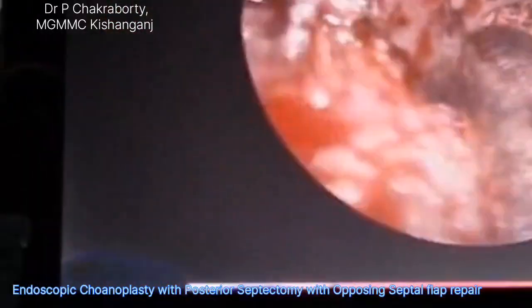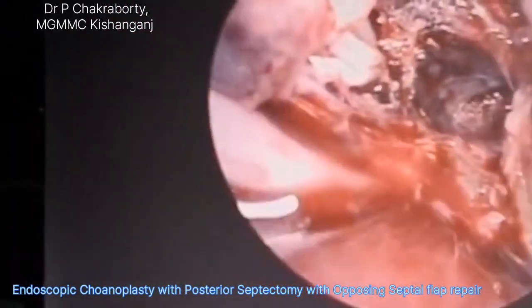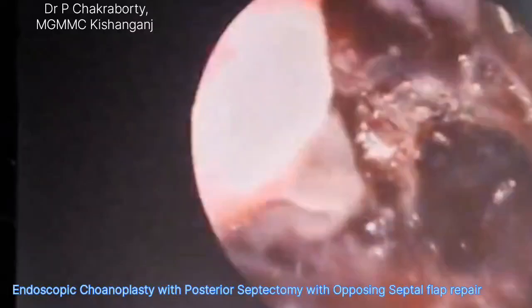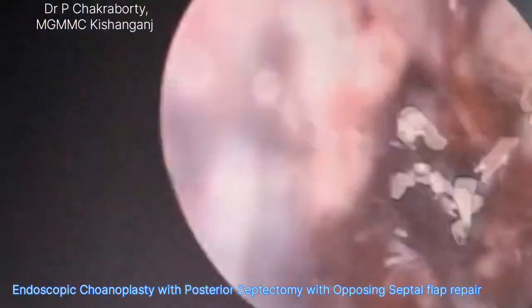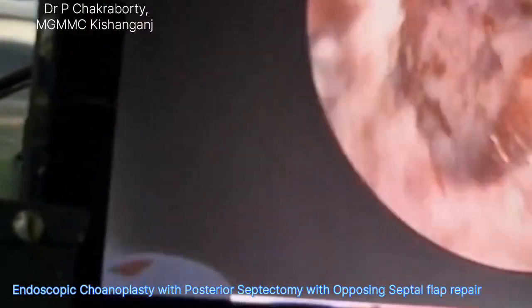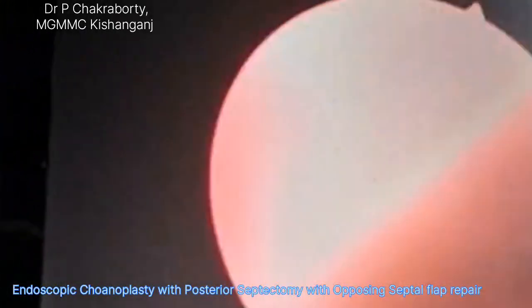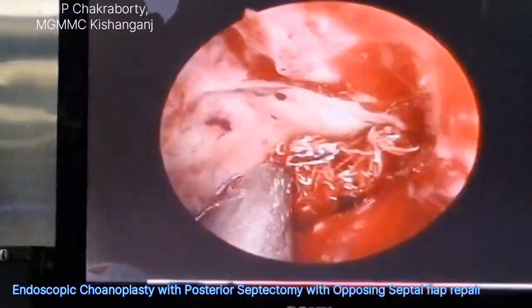We are converting both the posterior choana into a single large opening without the intervening septum in between. So we have converted the posterior choana from both sides into a single large cavity. We can directly see the throat pack from the nasal cavity. This is the throat pack which is seen within the oropharynx, and the widened nasopharynx is clearly seen, and there is no intervening septum in between, so both sides of the nasopharynx are clearly seen.